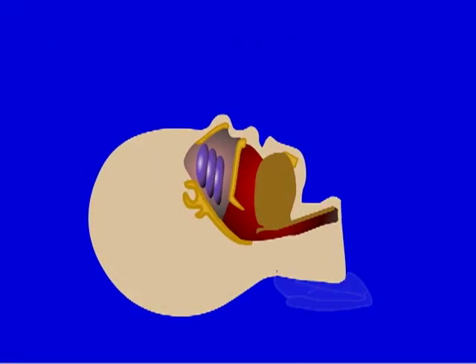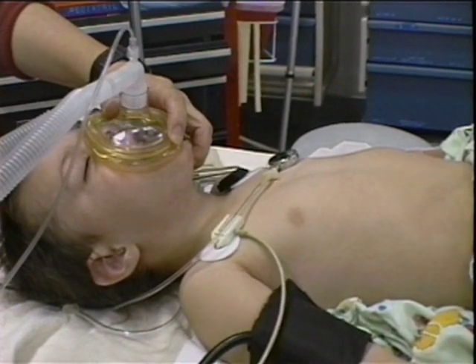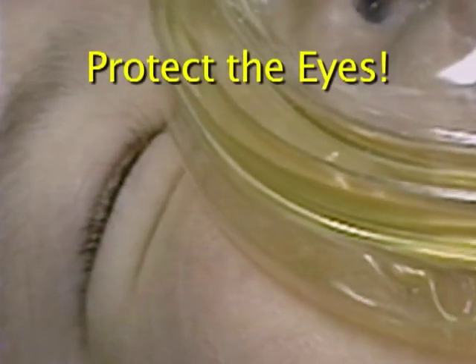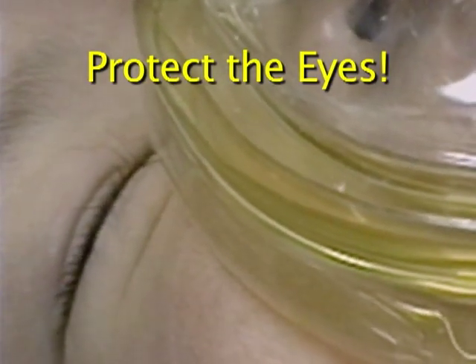Placing a small folded towel under an infant's shoulders sometimes helps to open the airway. Pillows are seldom needed and may worsen airway obstruction in a baby or toddler. Protect the eyes. It's easy for the mask to push open the eyelids, exposing the eyes to corneal abrasion. Consider taping them closed if the patient is unconscious.